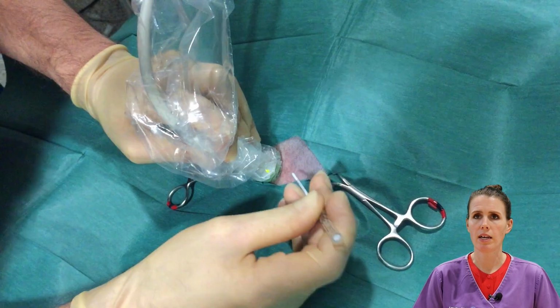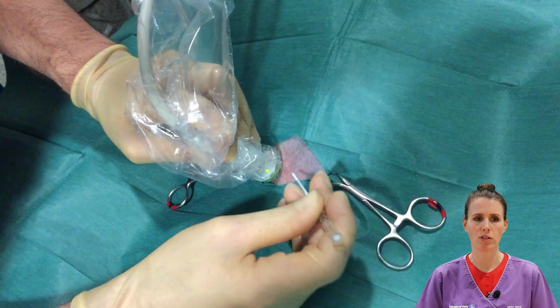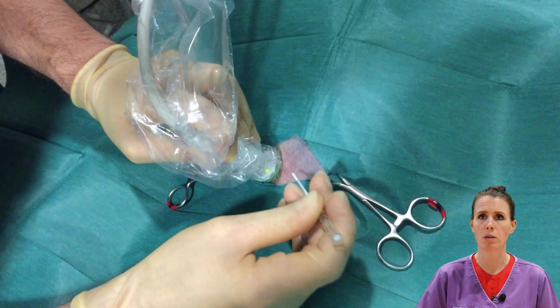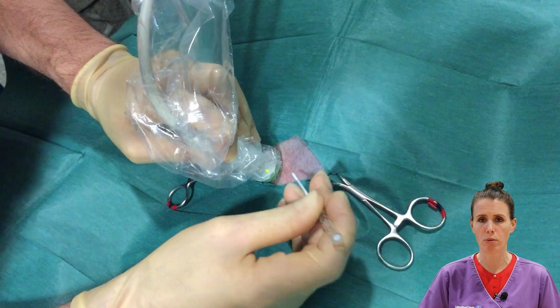So just one thing to say about ultrasound probe placement when we're draining effusion. Much of the time it's appropriate to do blind thoracocentesis at the landmarks we've described. It's also appropriate to do ultrasound guided thoracocentesis, and that can be anywhere we see an appropriate pocket. And if we're doing that, we need to make sure the alignment of our ultrasound probe matches up with our needle so that we're seeing the needle well into the field of view.